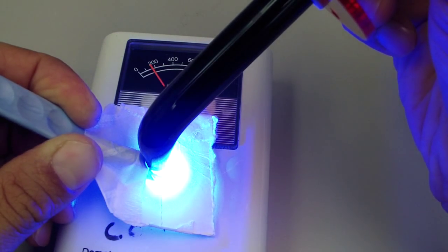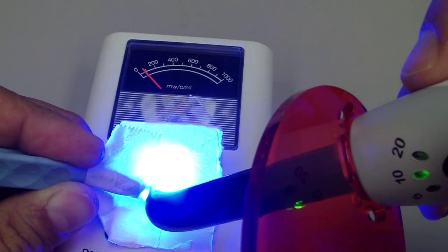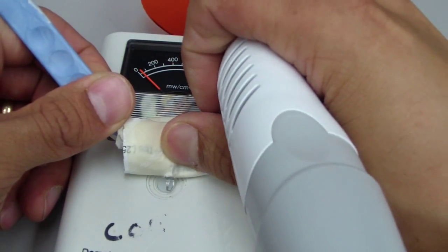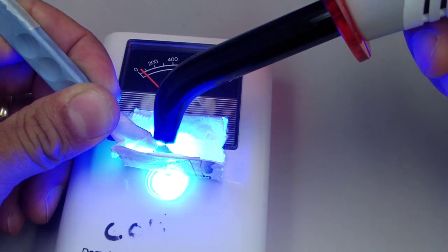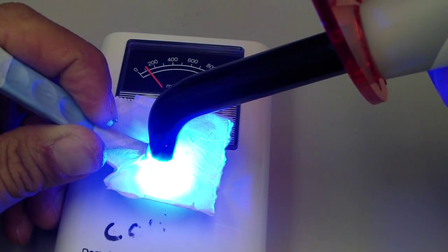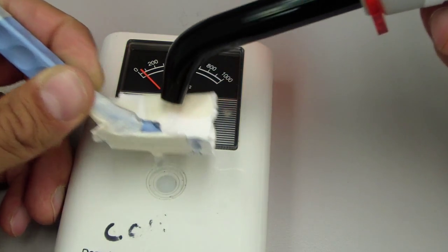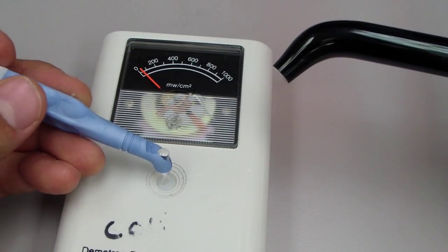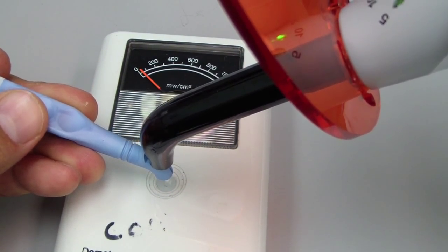So we're aiming for just under 200 mW/cm². I'm going to change the angles because some folks mentioned before, like with the light post, it might be the angulation. We're still around 100. Maybe 10% of light is actually going through the transmissible little clear proximal former.